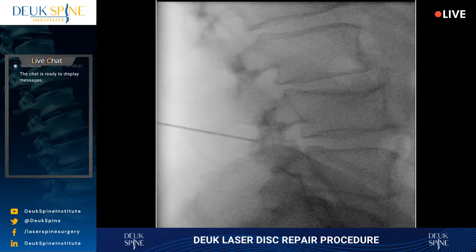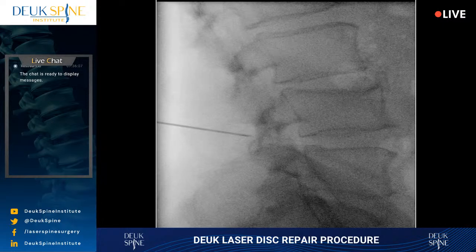All right, we're aiming for L4-5. That's the L4-5 disc I'm going towards. I'm right near the facet joint. I have to navigate around it. It is a little bit arthritic, but that is not the primary source of pain. I believe the disc herniation is.